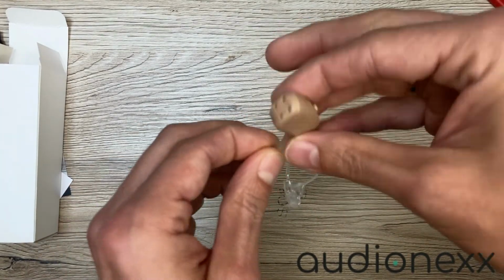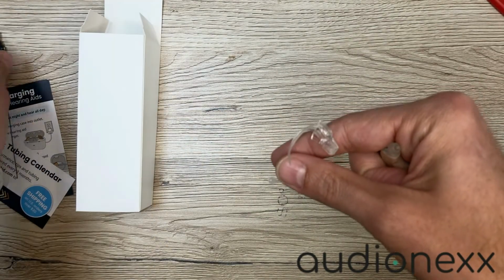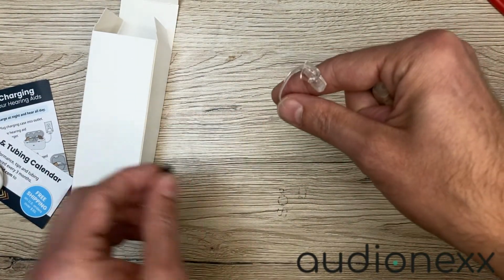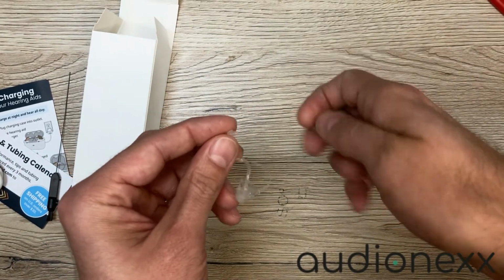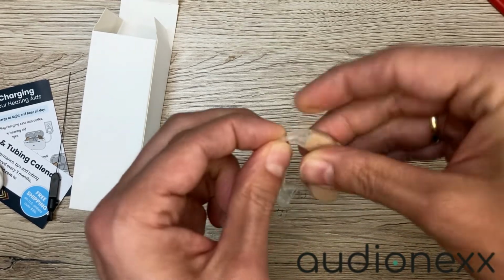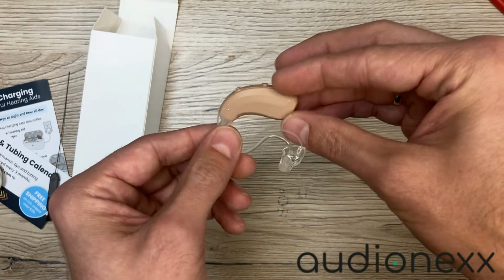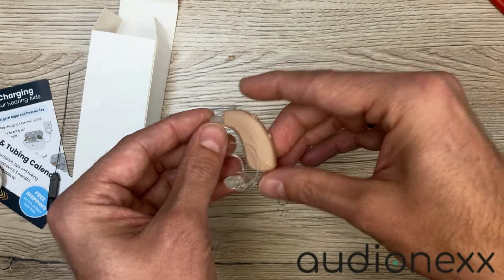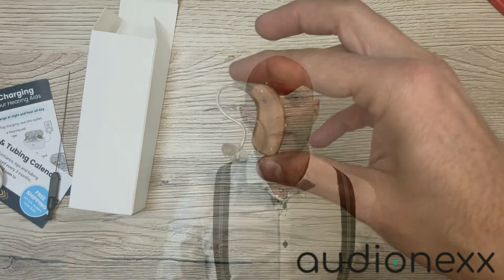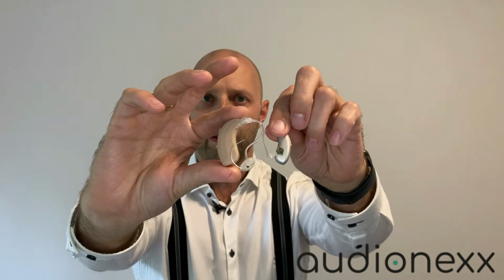If you need to clean the slim tube, you unscrew it here and you usually clean it with this wire here. Just stick it through. That's how you clean those devices. But just want to screw it on. Okay, but all in all, this is a pretty huge hearing aid, and I'm curious how it will fit behind my ear. So as mentioned before, the Volt Max are pretty huge hearing aids compared to other brands' rechargeable devices.